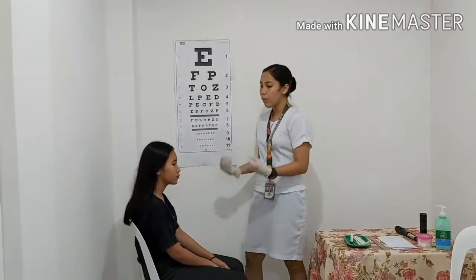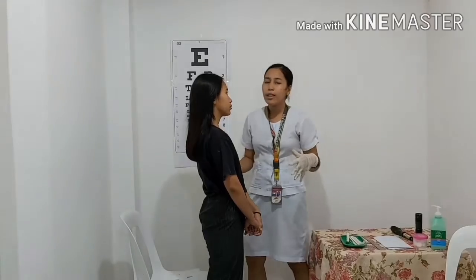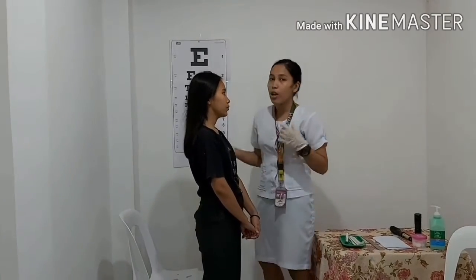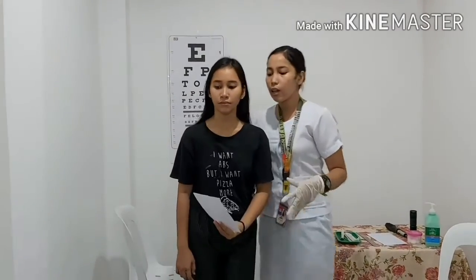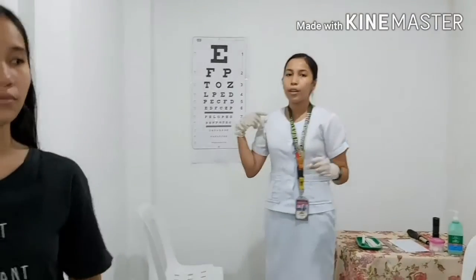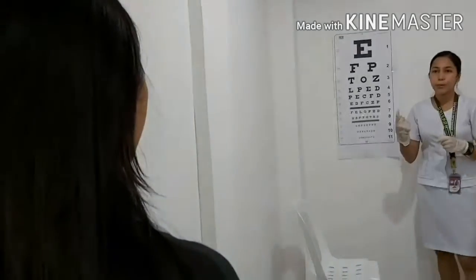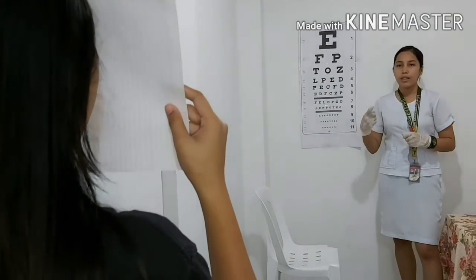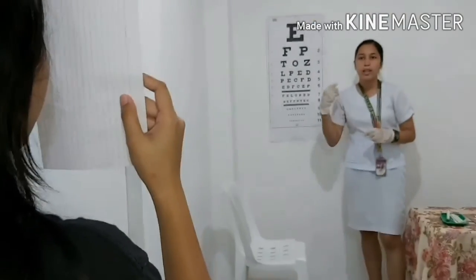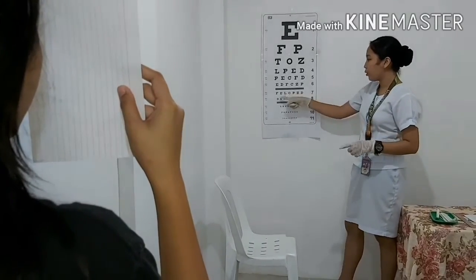The client should stand at a distance of at least 20 feet or 6 meters away from the Snellen chart. And by the use of the index card, we need to cover the portion of the eye that is not being tested. So, please cover the right eye. And then, we need to check the visual acuity of the left eye. Then, please read the smallest letters you can read, starting from F, P.